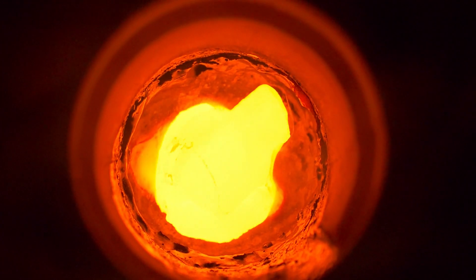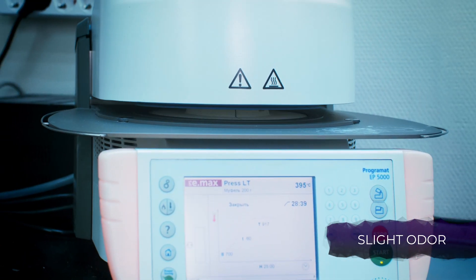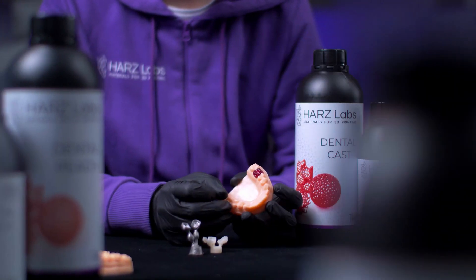Harz Labs DentalCast has a mild odor, burns out without ashes, and is an excellent choice for direct casting and pressing of dental implants. It's suitable for use on 3D printers of most leading manufacturers and has been well accepted among professionals around the world.